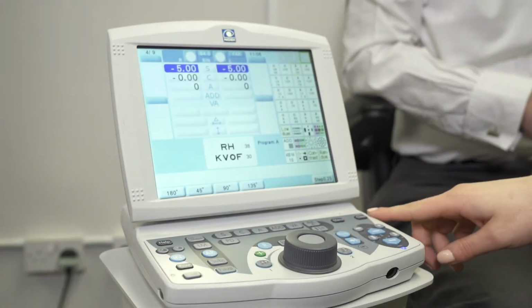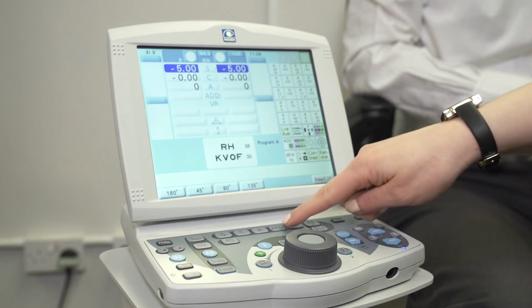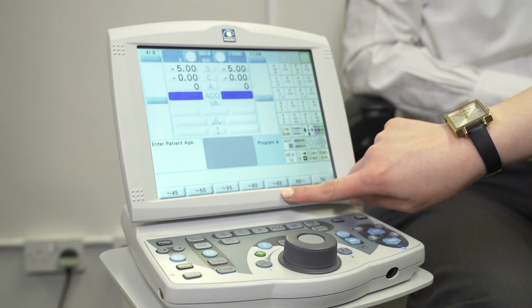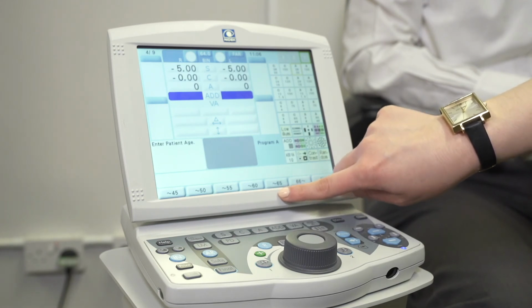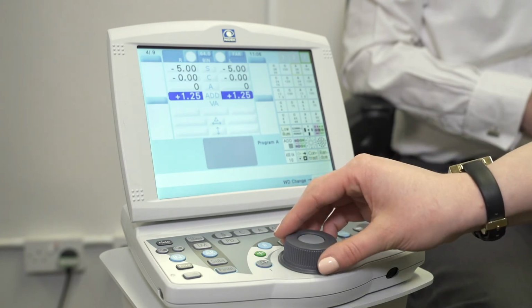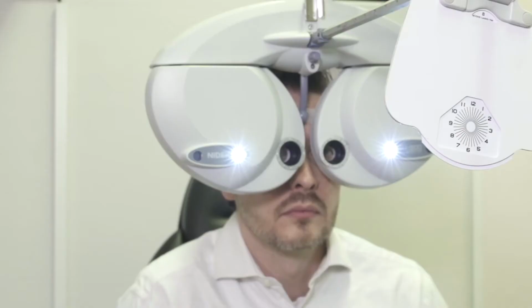To enter into the reading mode on the control panel, press the add button, and then it'll give you an option to select the patient's age. From that, it'll give you a starting point for your reading addition. You can then use the dial to scroll up and down, asking the patient whether the vision becomes clearer or worse with the 2 options.